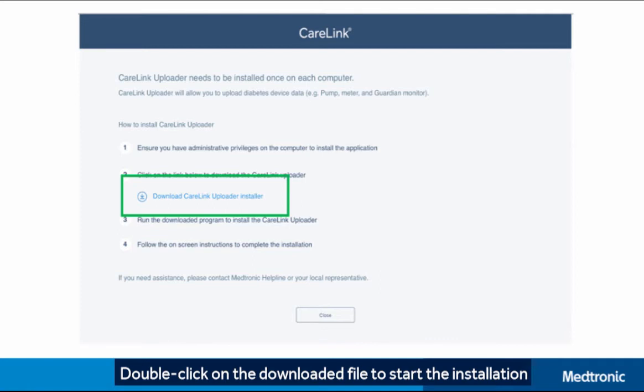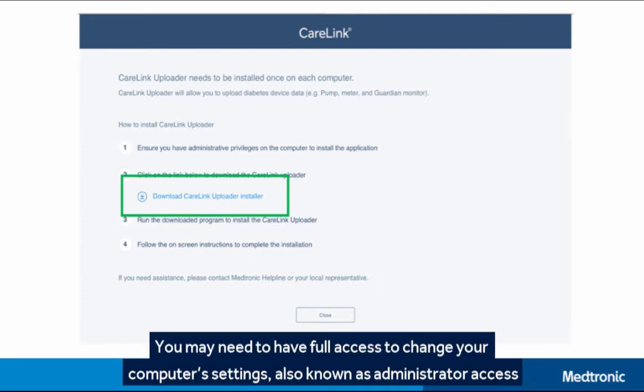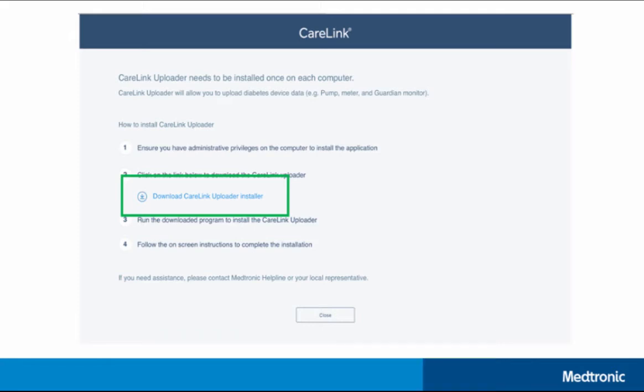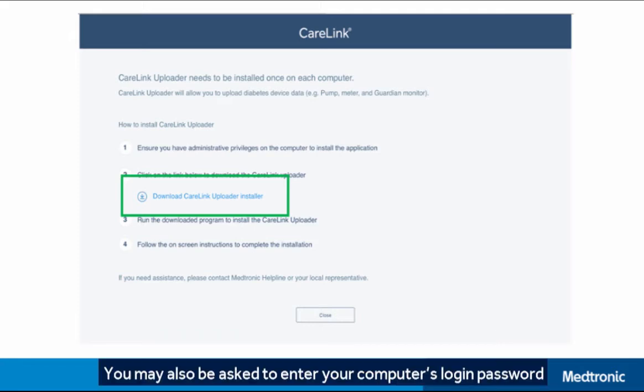Double-click on the downloaded file to start the installation. You may need to have full access to change your computer settings, also known as administrator access. You may also be asked to enter your computer's login password.